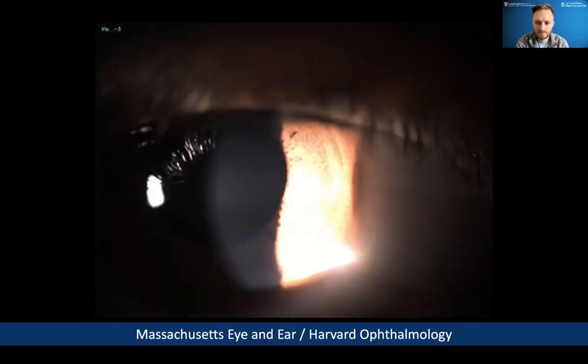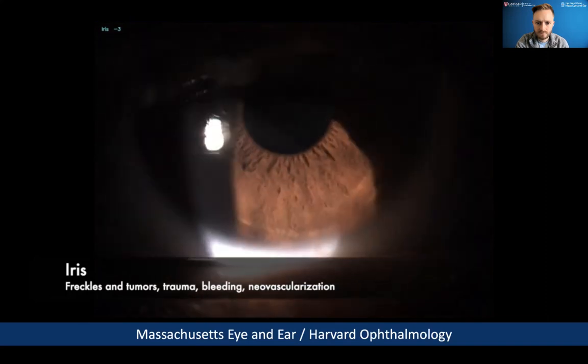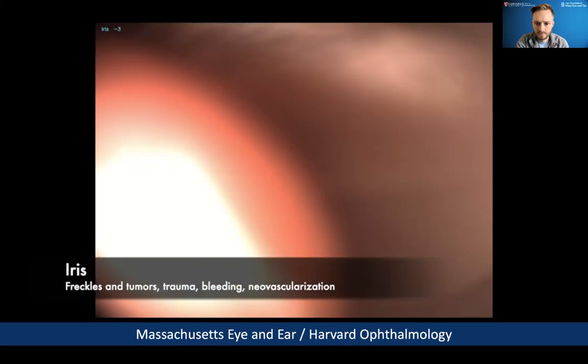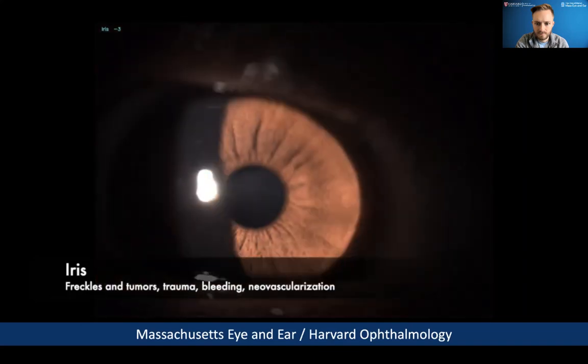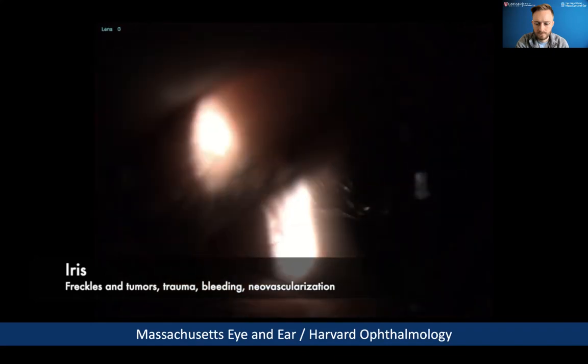We'll now look at the iris. The iris is a beautiful structure. In this patient, it's brown, and you can see the small crypts on the surface of the iris. Every single person's iris is different from the next. And so it's a very beautiful structure, but also important to look at for things like diabetic changes and otherwise.